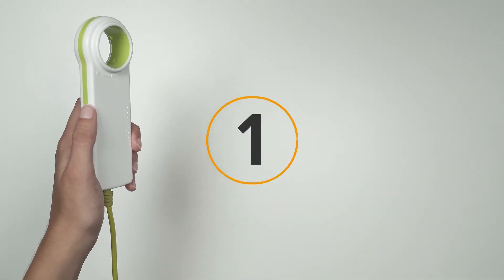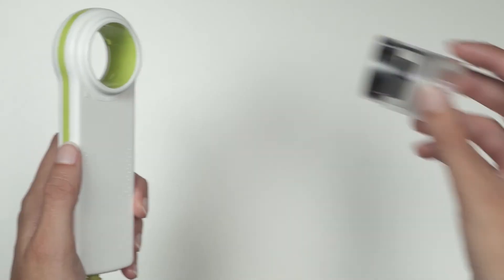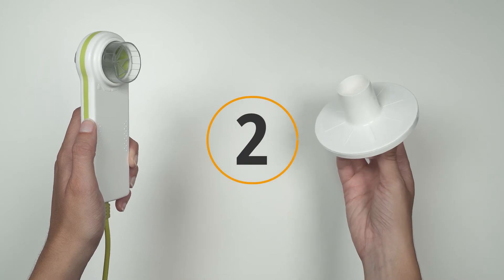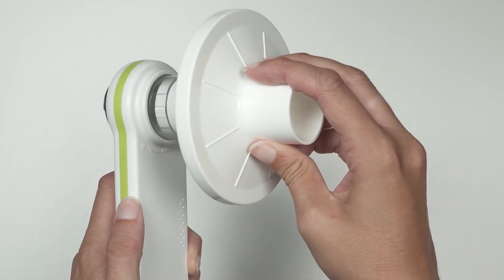Start by placing the turbine into the spirometer, then lock it by turning clockwise until it stops. Unseal the antibacterial filter and fix it to the turbine.